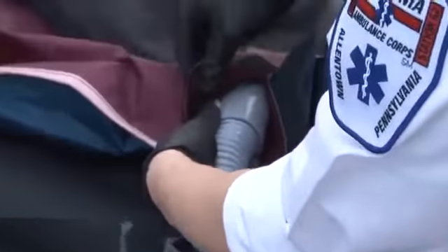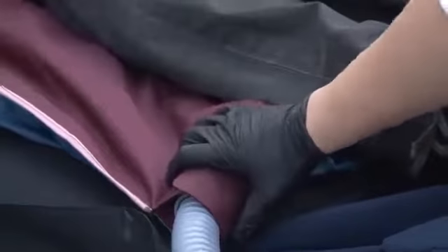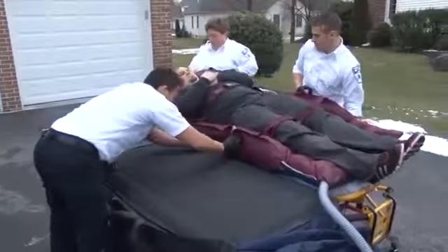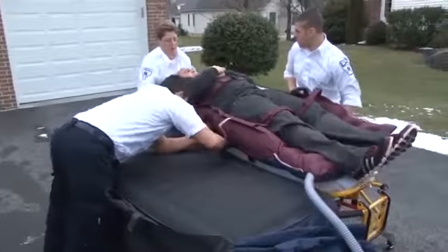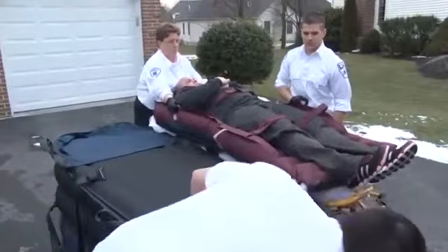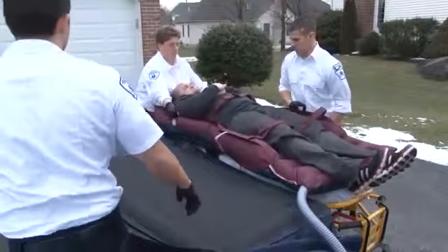With at least one crew member on the receiving side of the stretcher and another crew member next to the patient, transfer the patient from the Evacuation HoverJack 2 to the stretcher. One crew member will provide a visual check at the head end to ensure the patient is centered on the stretcher, and then inform the crew member at the foot end to press the power button on top of the air supply to deflate the HoverMatt.